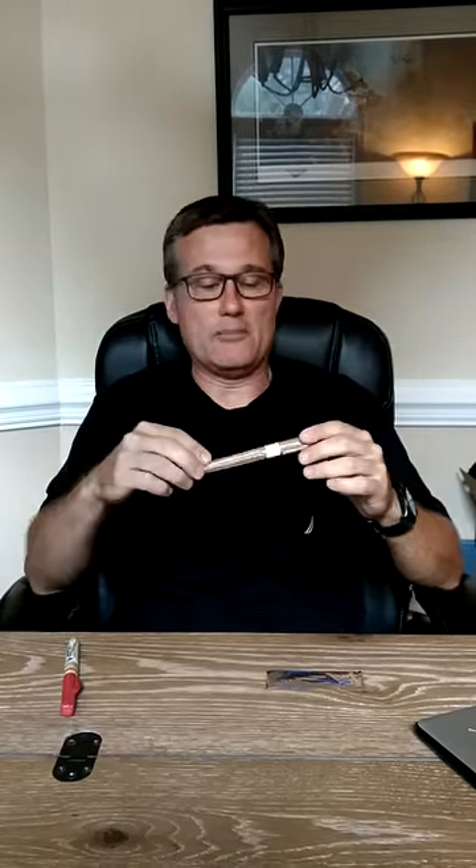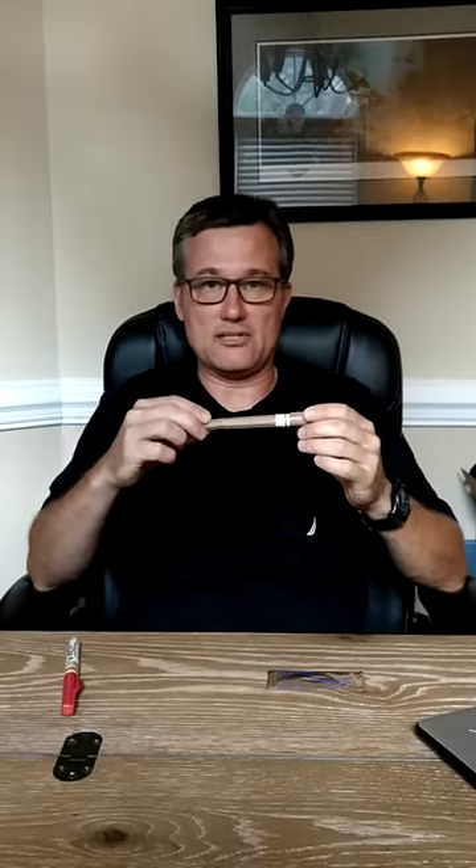The other one — somebody wrote in about the Mojo Dart. This here is the Mojo Dart. Once again, it's 3.25 inches long and comes in a hard container that you can use as a sharps container.